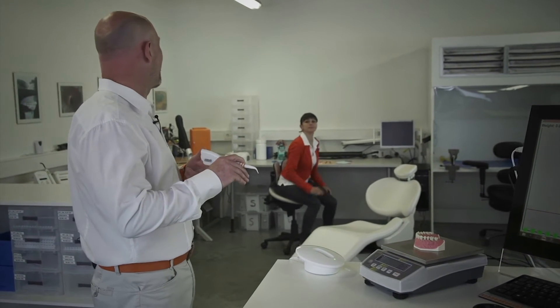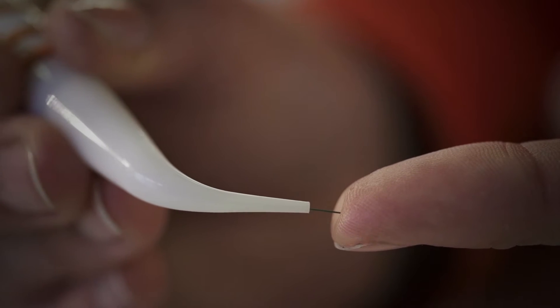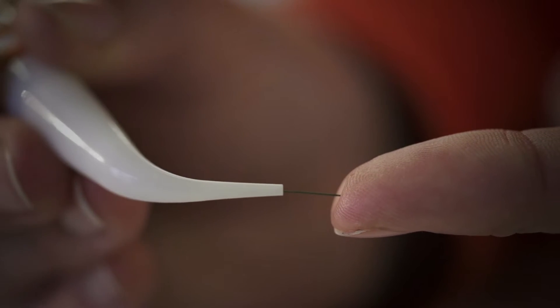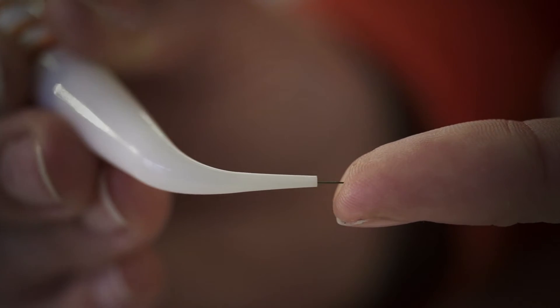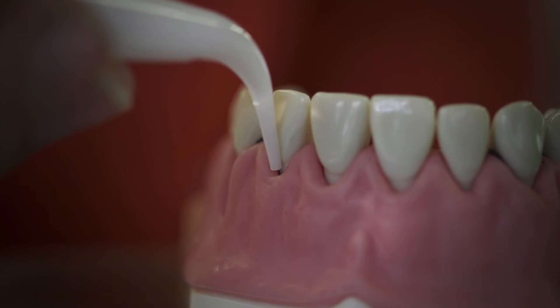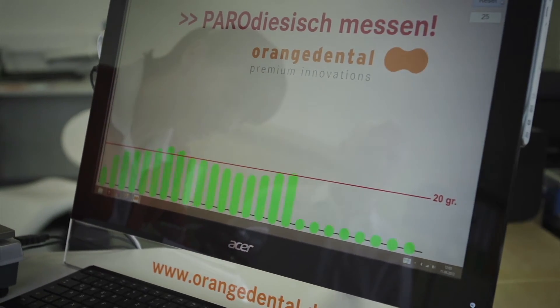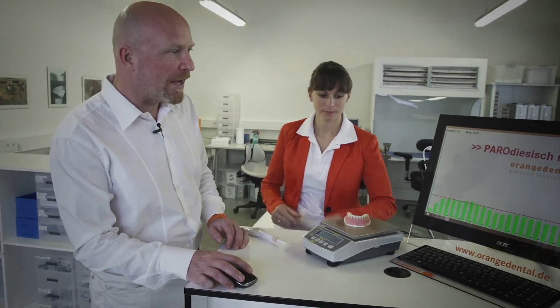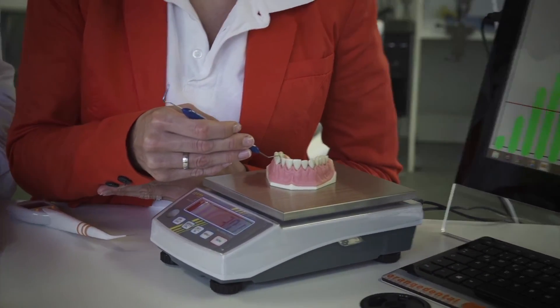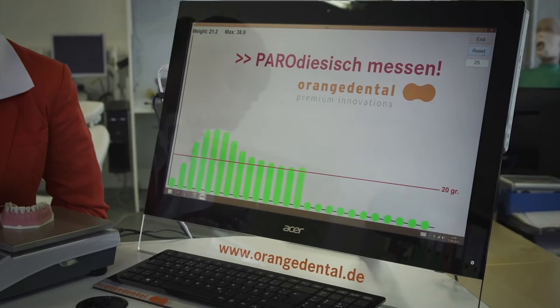Steffi, could you please help me? The measuring tip is extremely thin. The tip disappears into the probe head like a theater knife. The patient experiences almost no pain during the recording. The hygienic disposable measuring tip is calibrated so that it always develops precisely 20 grams of pressure. It is so difficult to always measure with exactly 20 grams using a manual probe.